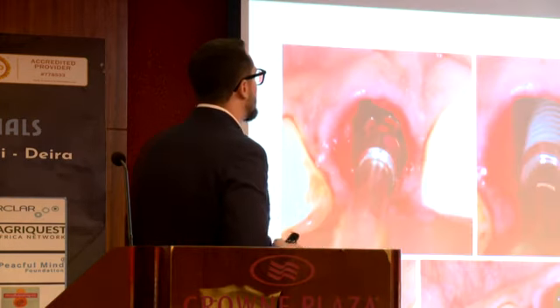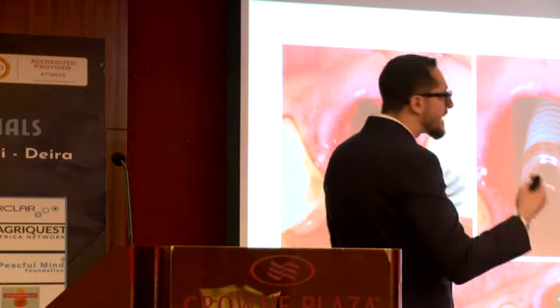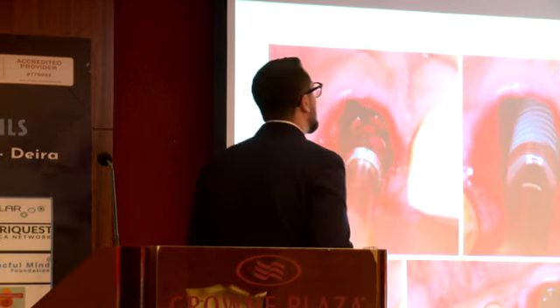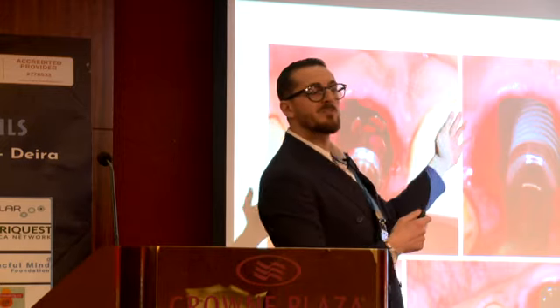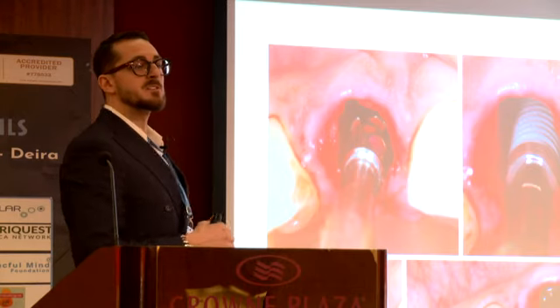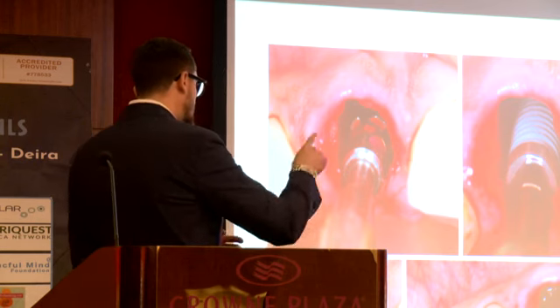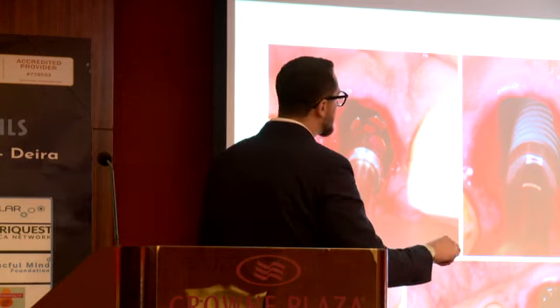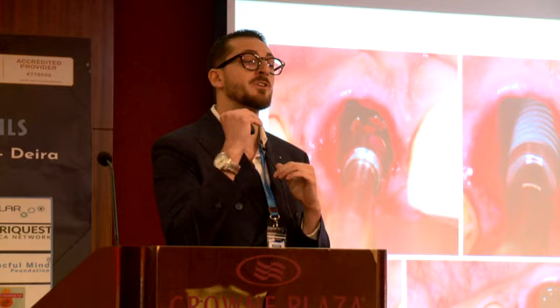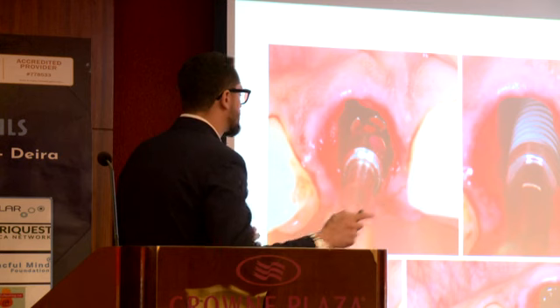So then the next step is to start drilling the bone. You have a three-pillar concept that we must respect in order to drill our alveolus. First, we have to respect at least 1.5 millimeters distance to any adjacent roots, and also 3 millimeters in cases where we have an implant on the side. Then, from an apicocoronal point of view, the implant neck should be located at least 2, maybe 3 millimeters from the free gingival margin of our future restoration. That's very important. I will explain next why.